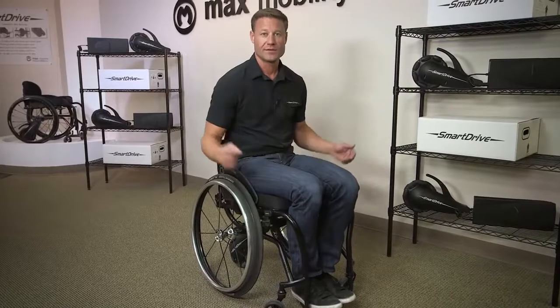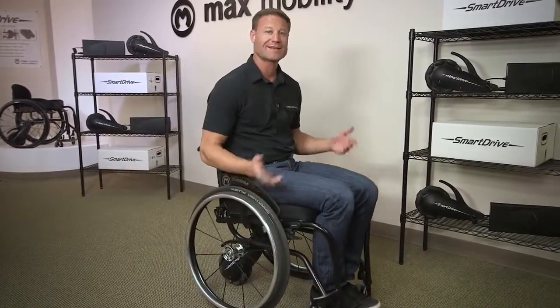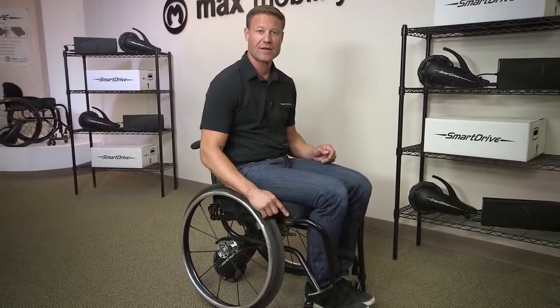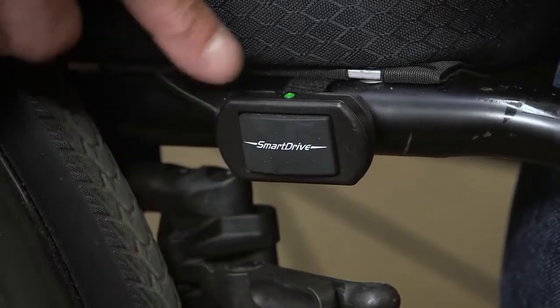Next, let's talk about how the buttons work. There are 2 buttons, one on each side of the chair. Each button has the same function. There are 2 of them, so you can access either one, depending on which hand is free. Each button has a large, highly sensitive switch and a green status light. The light tells you whether the SmartDrive is on or off, and which mode it's in, and the battery level.